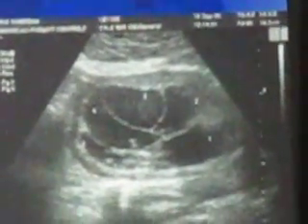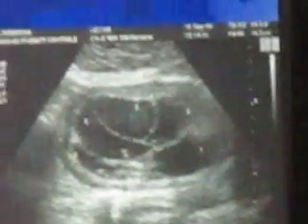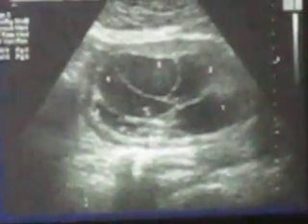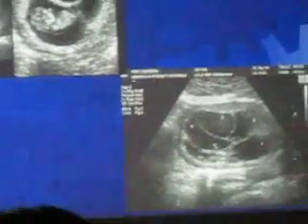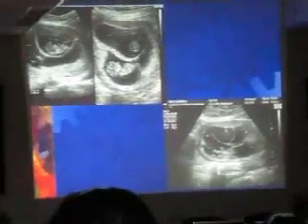One. Second is, before 10 weeks, even if there are 2 fetuses, for example at 7 weeks, by the time you come to 10 weeks, it may actually become 1. It can spontaneously reduce to 1. That is why the number of fetuses is usually declared on seeing distinct fetal cardiac activity. It is not the number of sacs. It is not the number of membranes which you see.